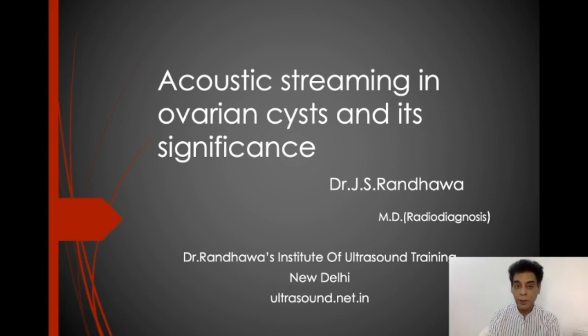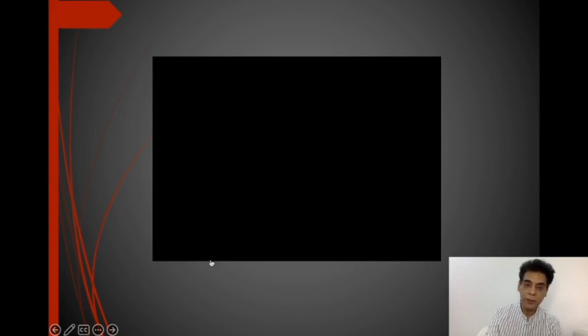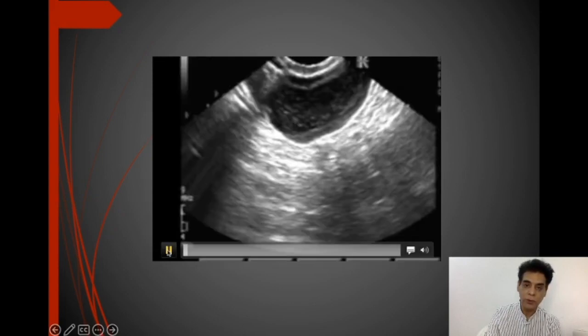Today I'll be taking a topic of great practical significance, and the importance is not only for those who are fresh, but those who have been doing ultrasound for years will also find this topic to be very beneficial. Now, let us start with a video. Now, if you go to this video, let us see this video.